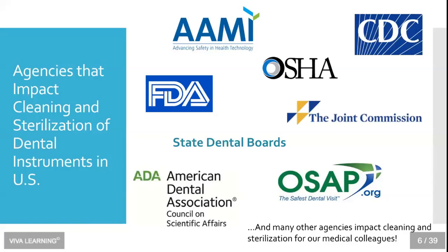The Joint Commission is an accrediting agency that may impact those of you who practice either in large group practices, some DSOs, hospital settings, institutional settings, military settings, general practice residency programs, etc. So you might need to be aware of that agency as well.